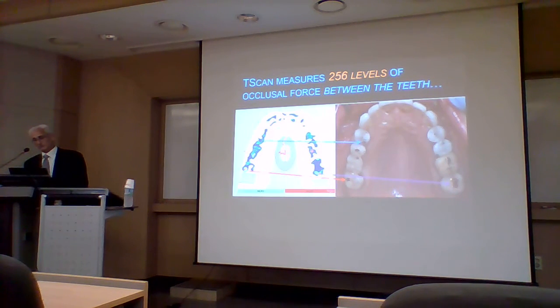컬러 코드로 나타내는 거예요. So the challenge for us in daily practice is how to interpret these marks intelligently so we can choose the correct ones to treat. And the T-scan makes that very simple for you. 임상에서는 T스캔 도움 없이 하게 된다면 날마다 추리를 해서 잡아야 되는 것들이 있는데, T스캔을 쓸 경우에는 그런 것도 조금 더 쉽게 결정할 수 있도록 도와줄 수 있는 에이드 디바이스가 될 수 있는 거죠.